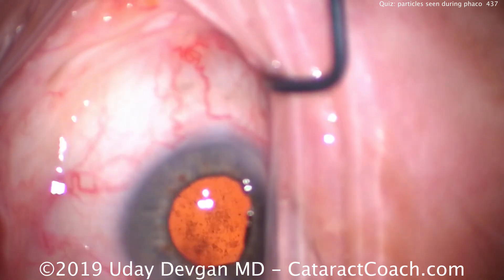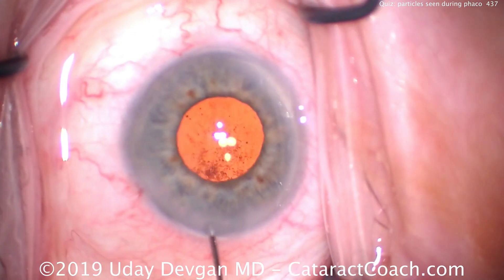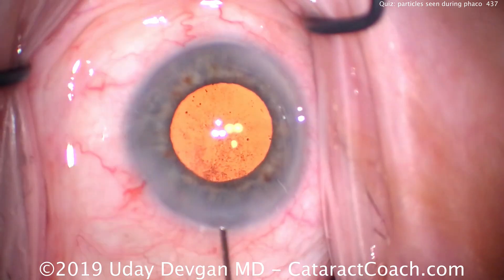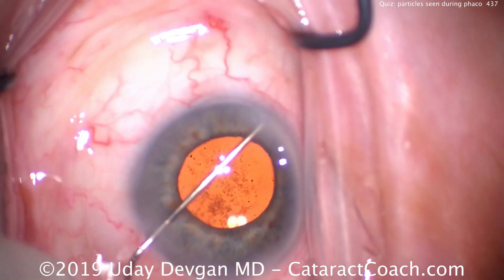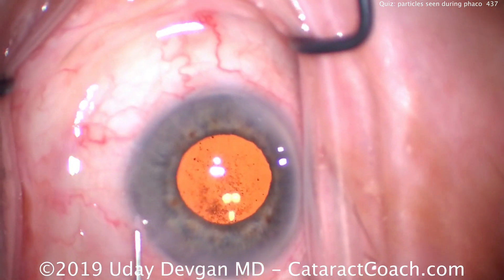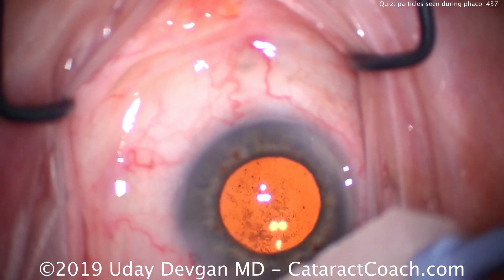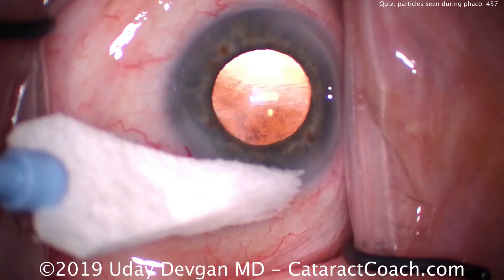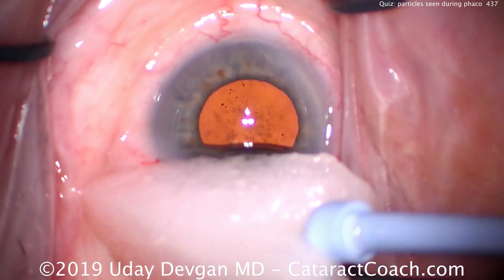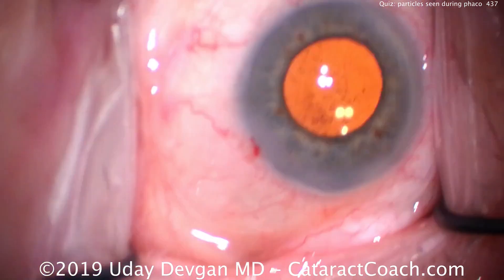So what do you do here? Do you do a posterior capsulotomy and then an anterior vitrectomy? You could, but it's not really needed — this is a very small amount of lens material. We've adjusted the video in post-processing to really amplify and show you those in detail, but this is a very minimal amount, and it will certainly dissolve in the inflammatory cascade. We definitely expect this patient will have more inflammation in the post-op period, but we think the outcome is going to be pretty routine. There's no big chunk of cortex left, just these tiny dust-like particles of lens material that have gone to the anterior hyaloid face. Keep the patient on steroids for a longer period of time in the post-op period, and the patient will do great.